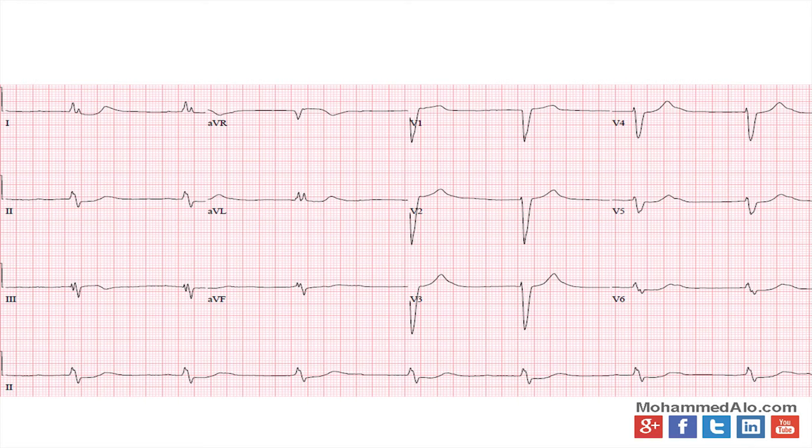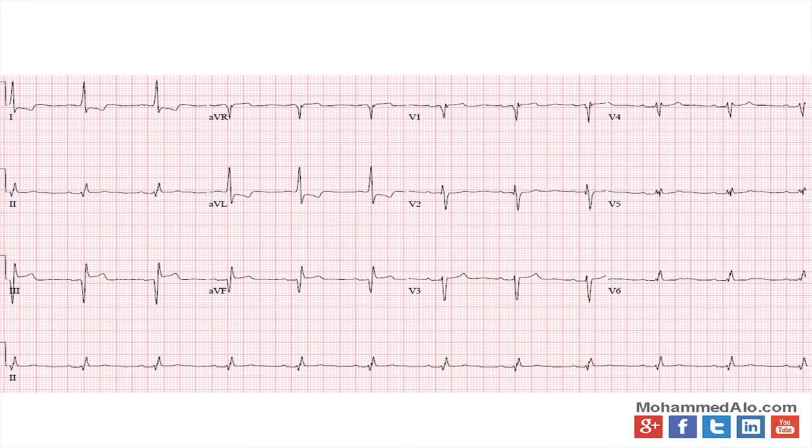Worse than that other person, you just want to be able to diagnose it. If you look at that S, the R is very sharp and then goes down quickly, and then that S kind of drags on and goes slowly.